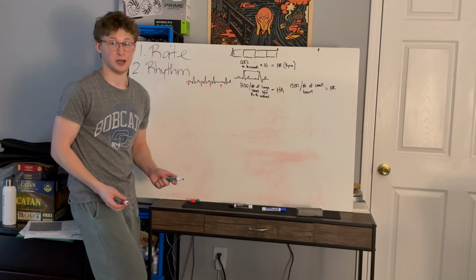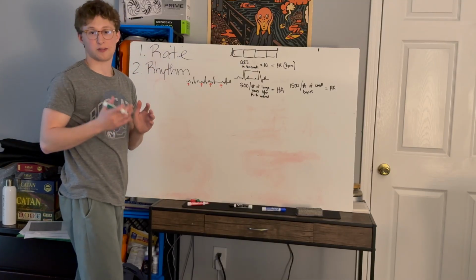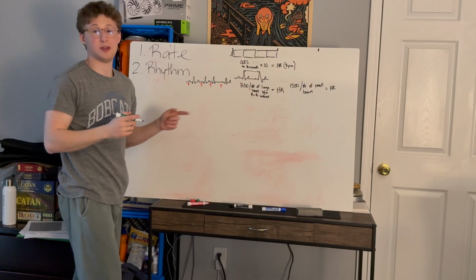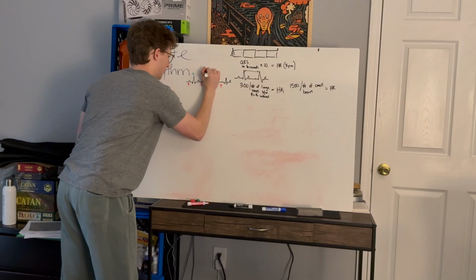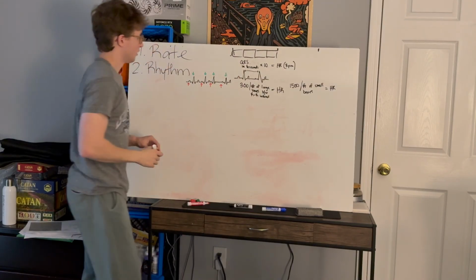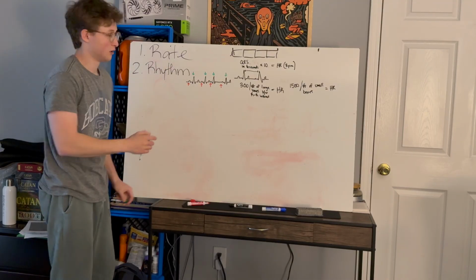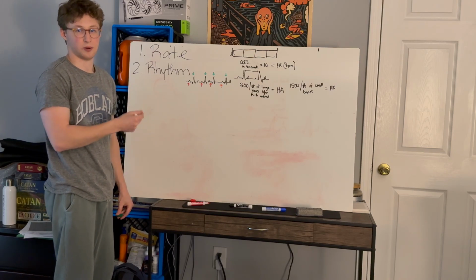Maybe you don't have P waves on your rhythm. So you could do your QRS complex to QRS complex to QRS complex. Again, just like we talked about here, it would be the R to R interval. So if you look at this rhythm, and again, there's no boxes, you can't really measure it, but just a rough idea: does it look regular rhythm or irregular rhythm?